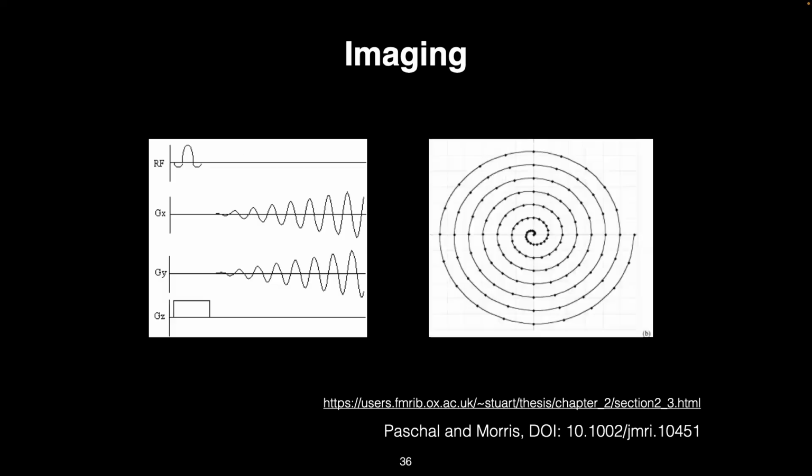That's not the only way. Spiral was in vogue for quite a while, and is still used for some applications where its properties might be more appropriate.